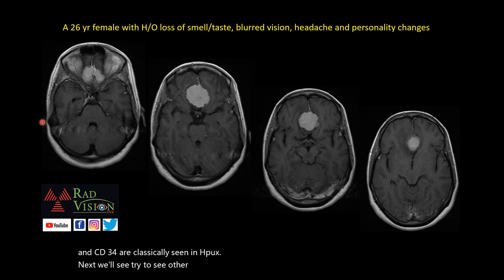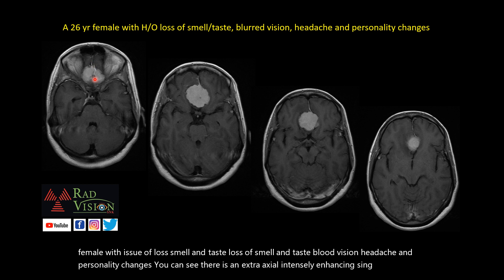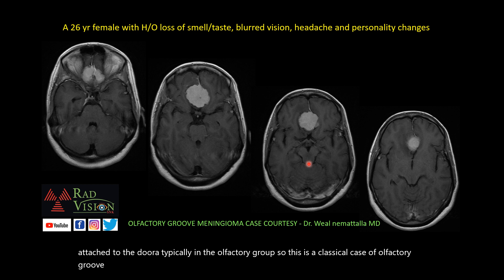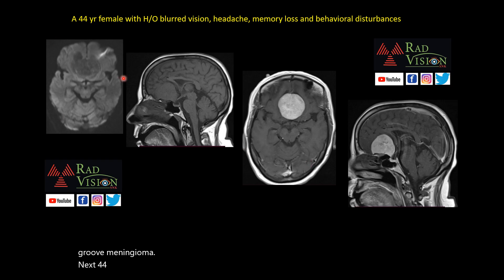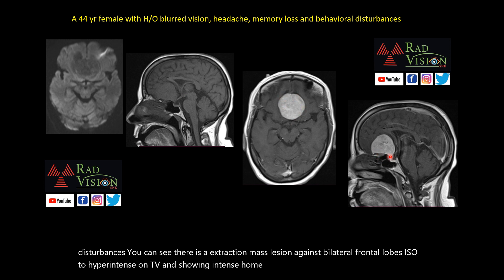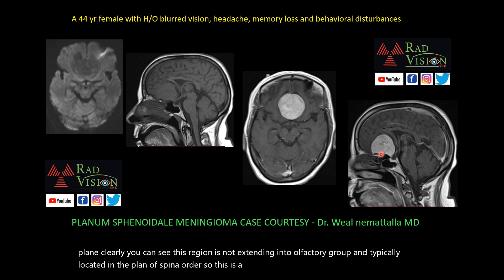A 26-year-old female with loss of smell and taste, blurred vision, headache, and personality changes: there is an extra-axial intensely enhancing mass lesion attached to the dura in the olfactory groove — a classical olfactory groove meningioma. Next, a 44-year-old female with blurred vision, headache, and memory loss: there is an extra-axial mass lesion against bilateral frontal lobes, iso- to hyperintense on T1 with intense homogeneous enhancement. On sagittal imaging, this lesion is not extending into the olfactory groove and is located in the planum sphenoidale — a classical planum sphenoidale meningioma.